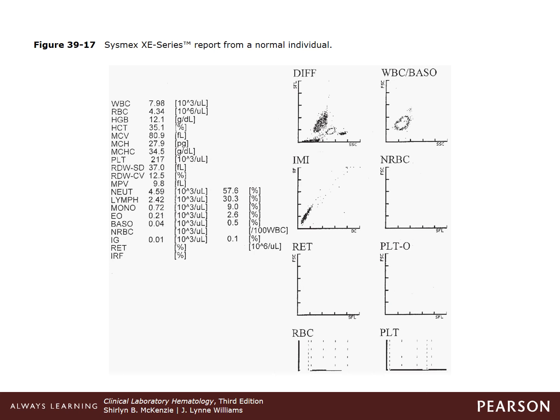The reticulocyte count is determined by the RET channel. Within here, the fluorescent dye penetrates the cell membranes, stains the blood cells, and binds to residual RNA within reticulocytes. The forward scatter and fluorescence information is used to generate this scattergram, and from this scattergram, cells are classified as mature red blood cells, reticulocytes, and platelets. The reticulocytes can be further classified based on their intensity to determine their maturity.